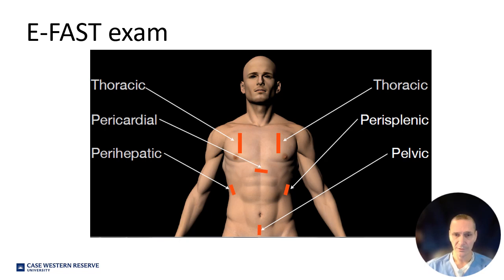These are the windows that you're going to look at. Looking for lung sliding here, right upper quadrant view is here, pelvic view is here, left upper quadrant view is here, and then the subxiphoid view is here.